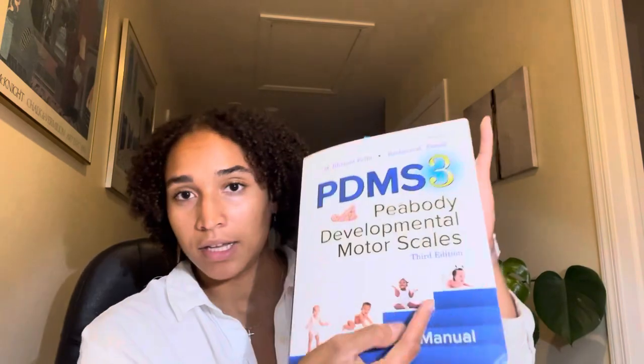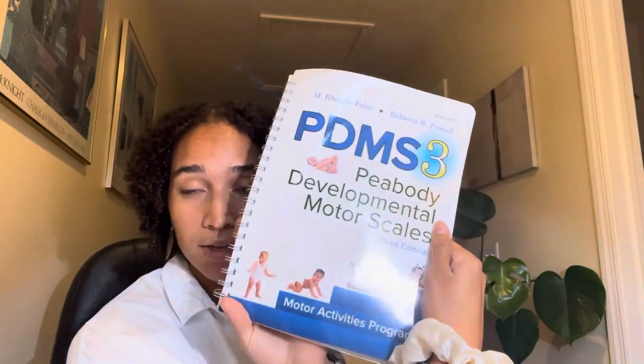Before starting the assessment, ensure that you have the PDMS-3 manual and the necessary testing items, like toys or objects for the child to interact with. Here you'll see I have the Peabody box. Inside the box, the manual is included, as well as the different materials needed for the assessment. Here's my manual. Also with the assessment comes a motor activities program.